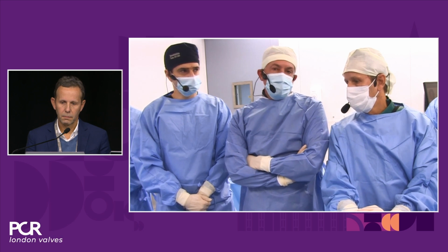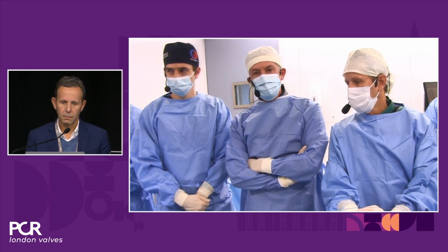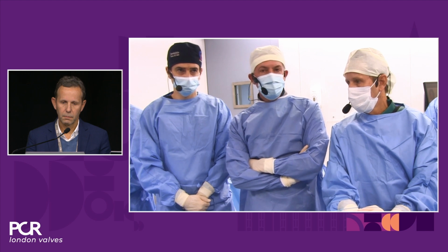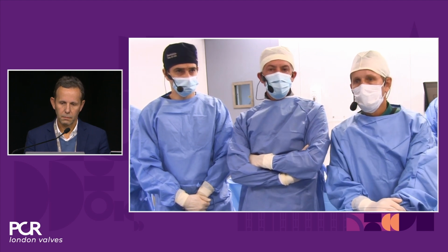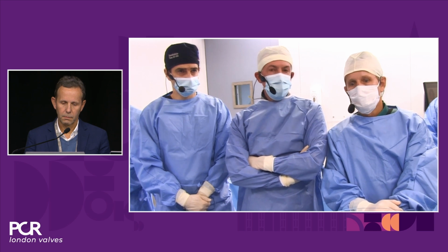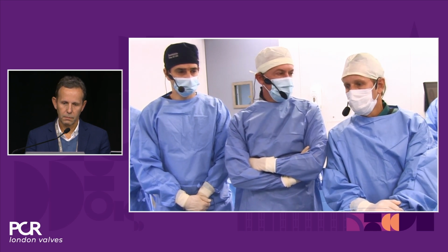One of the teaching points here that we're going to stress and discuss during this case is the fact that this patient has severe renal failure with close to 2 creatinine and very low clearance. And Fabio, any institutional protocol to treat these patients with severe renal failure?